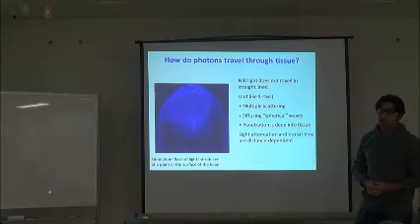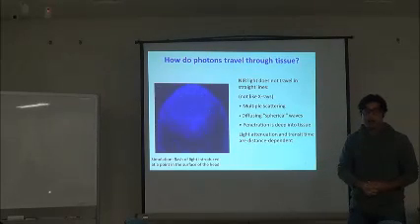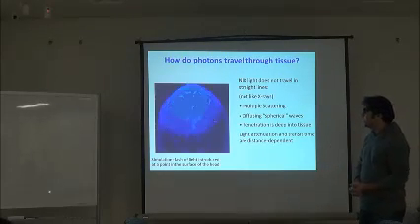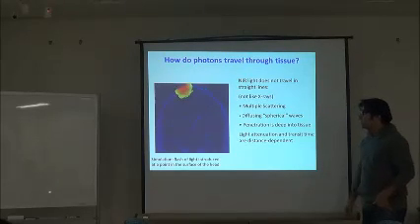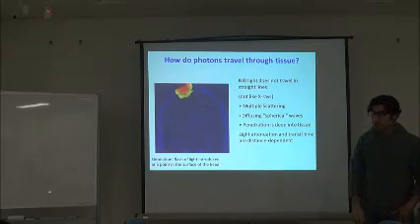If we use like a 10 milliwatt LED or laser, we can penetrate up to 3 centimeters in the human brain, and even more in the child's brain because the head is smaller. I will tell you in the next slide how we actually detect that light after throwing it into the brain.